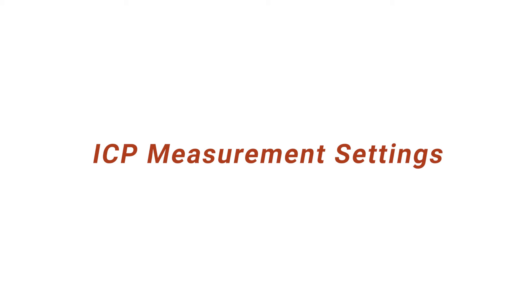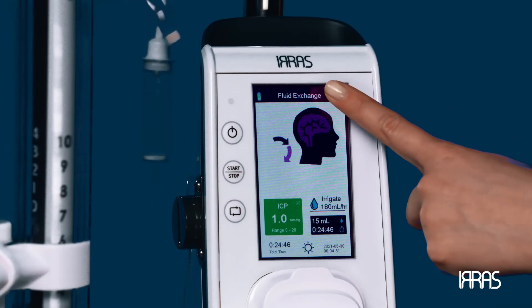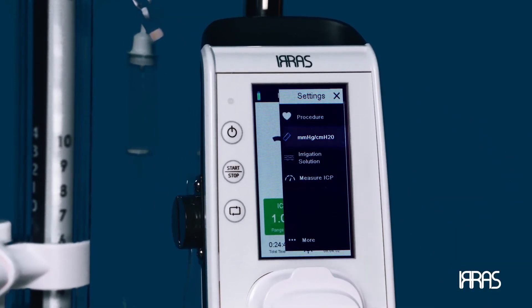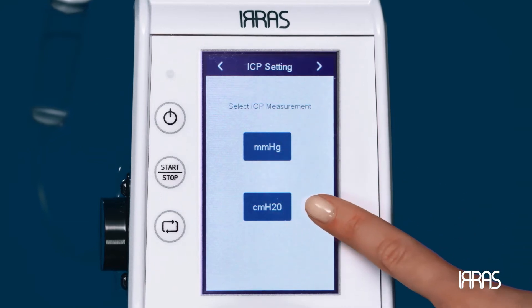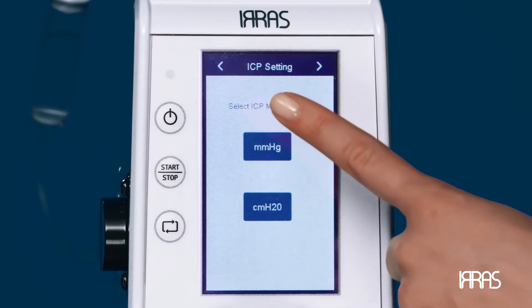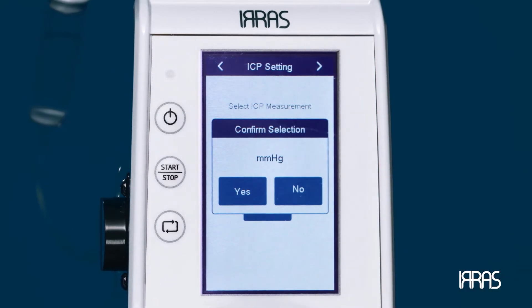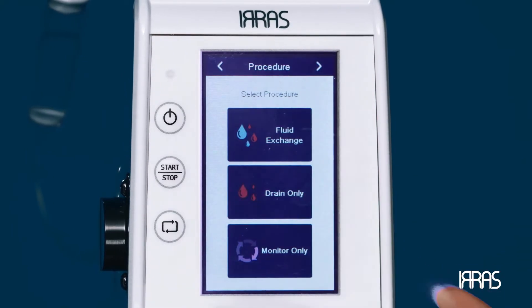ICP measurement settings — to change the pressure measurement settings, go to the settings menu and select the millimeters of mercury or centimeters of water option. Then select your desired measurement. Once you confirm your selection, the control unit will return to the main screen.